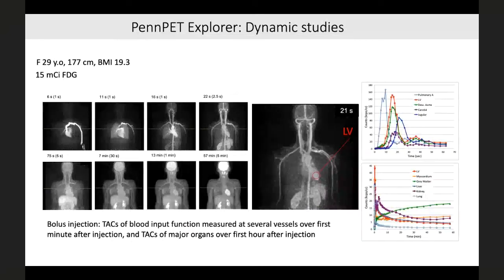So I think when we really start to get into what's relevant for the type of work that you're doing in the P30, this scan provides an exciting indication of what can be done. So this was somebody who was injected on the table. There's a little bit of a tour de force doing this in the lab that was building the scanner. We now have a dedicated scanning facility you saw.